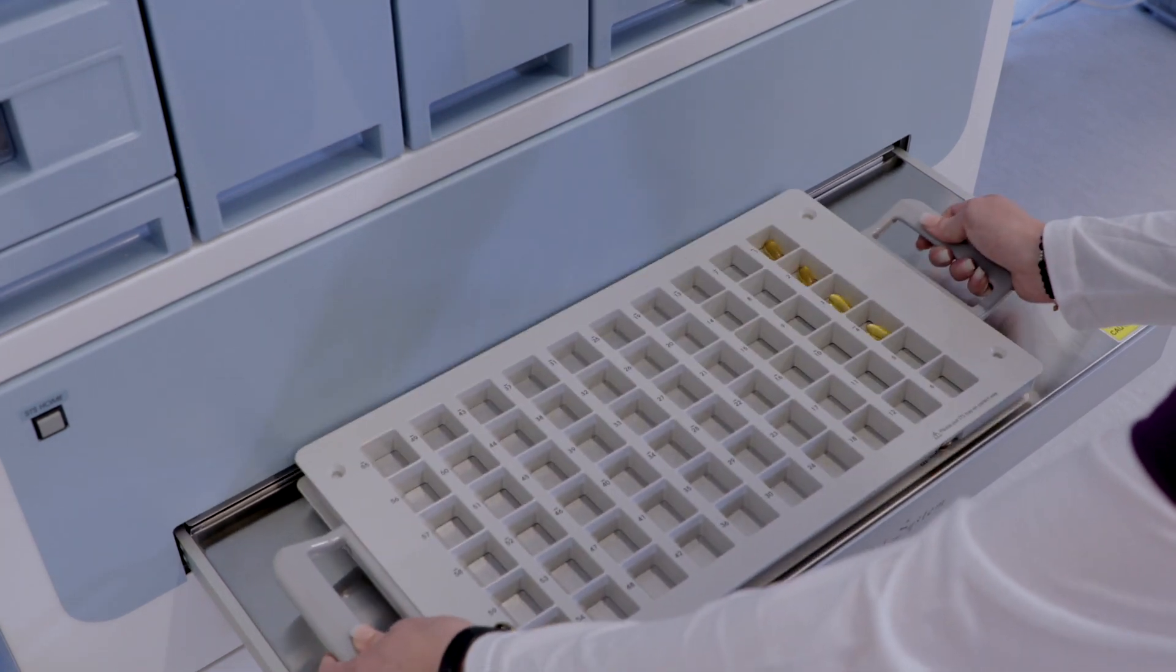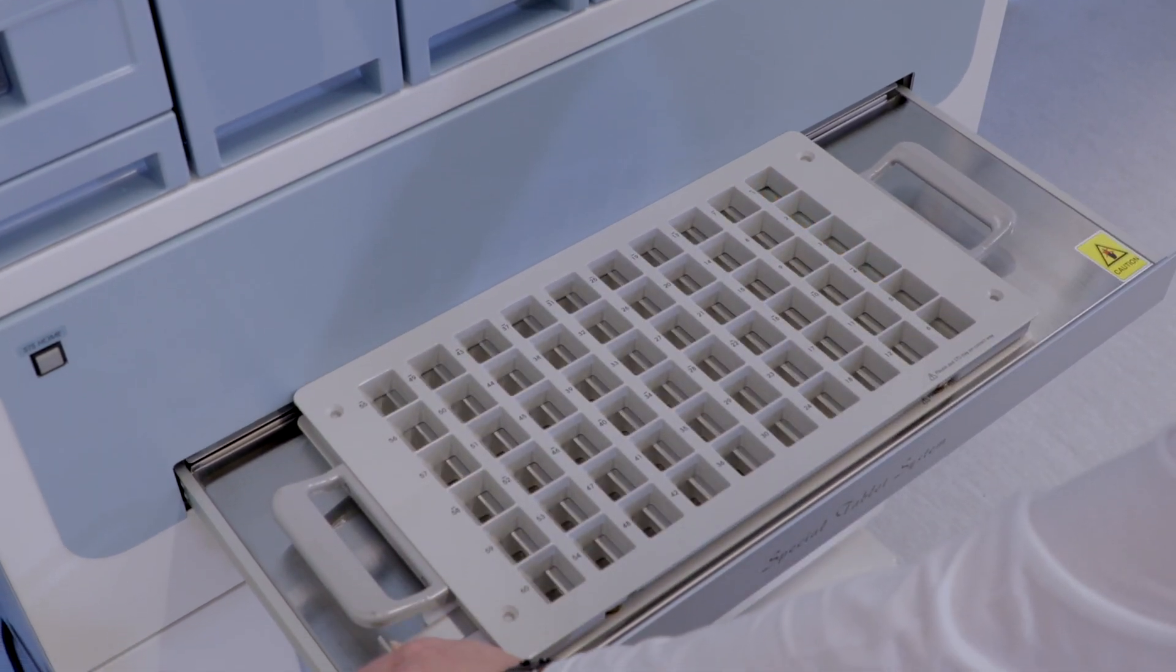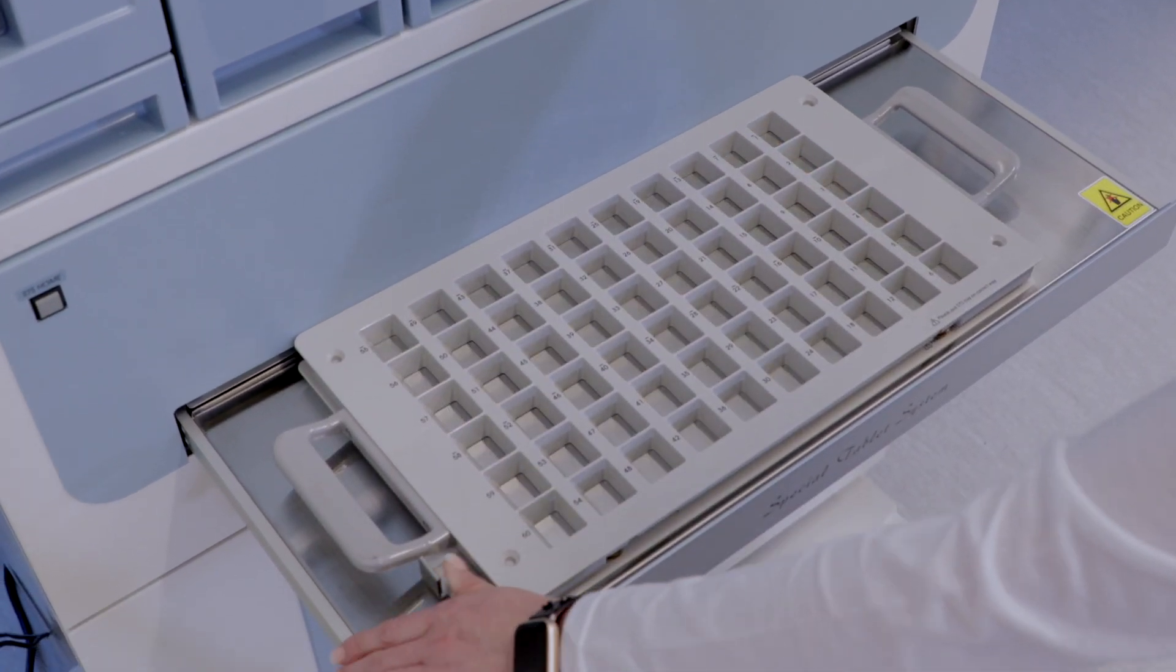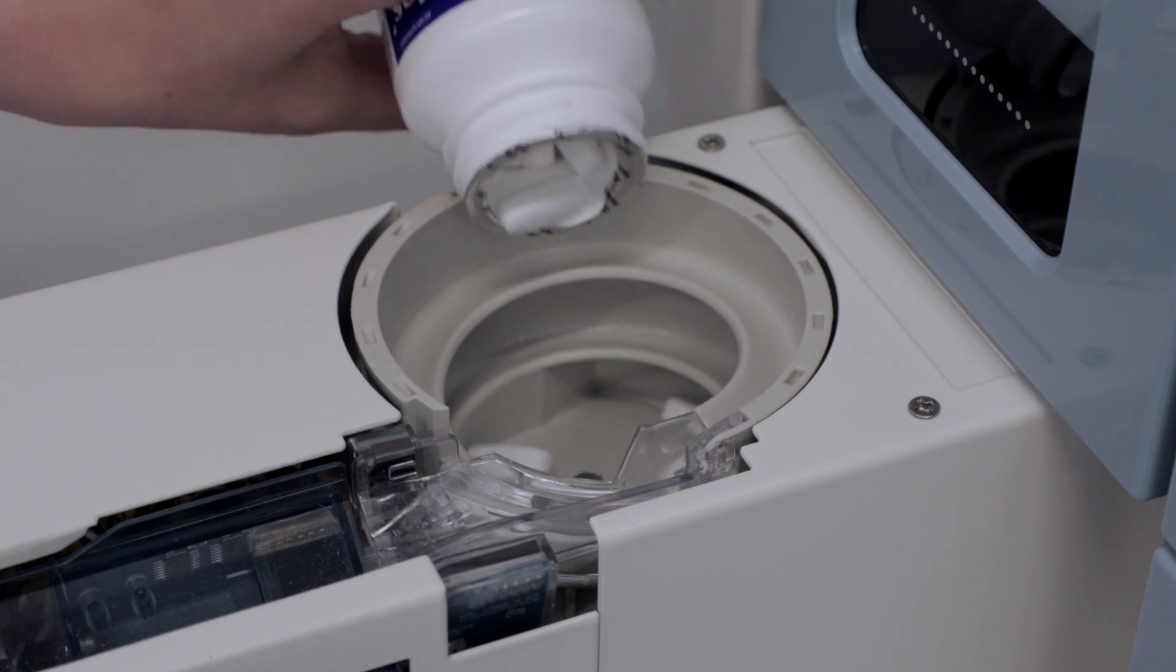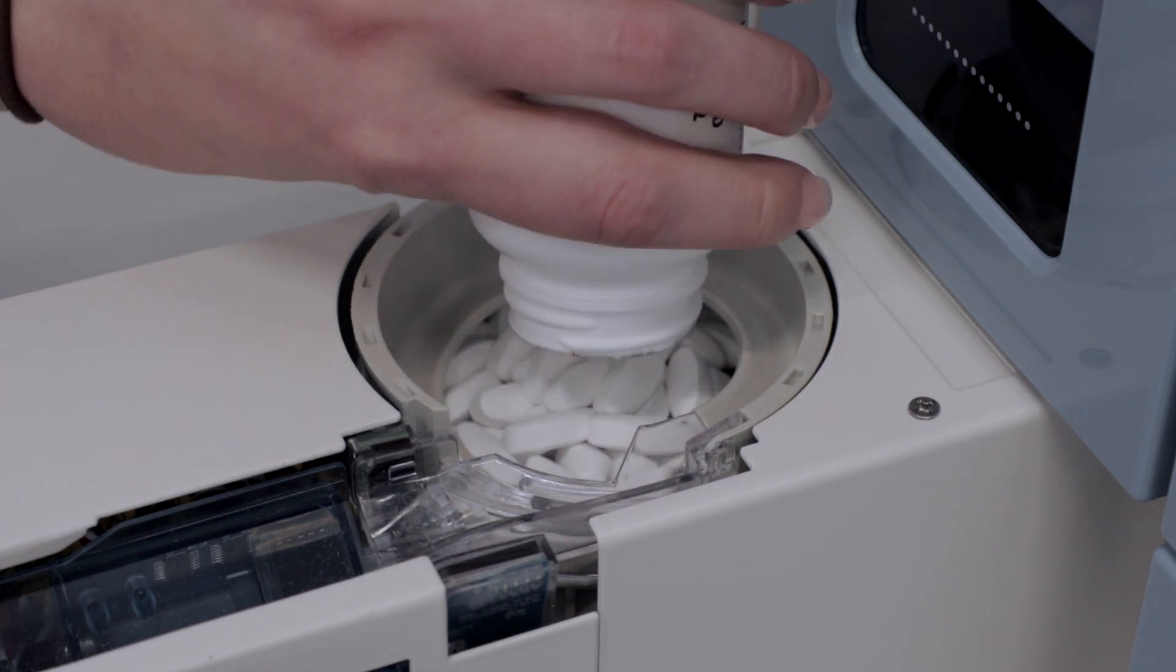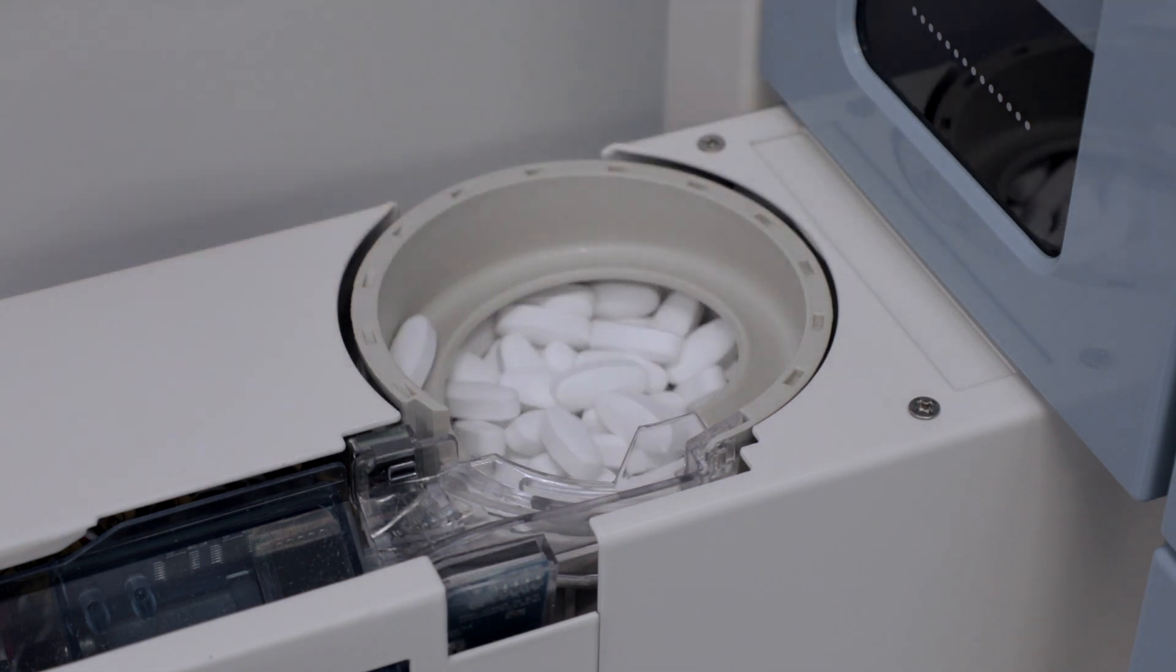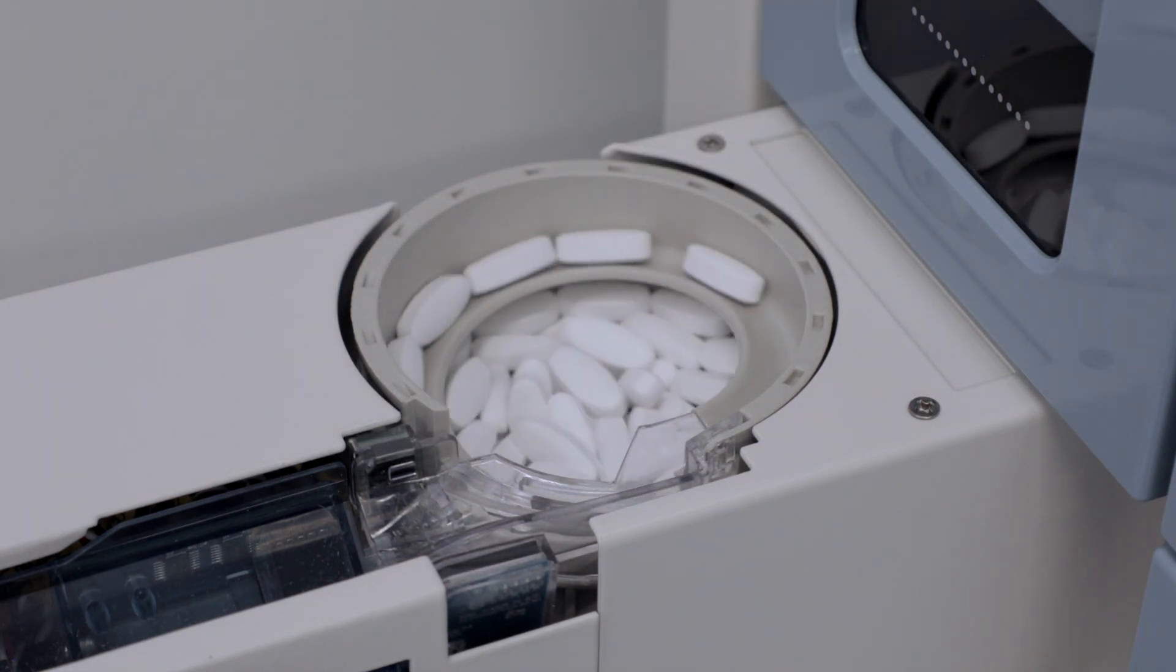The AutoPack features a lighted special tablet system (STS) tray and AutoCanisters that automate dispensing of half tablets, infrequently used tablets, tablets with special shapes, or any tablet that can be used in a canister.